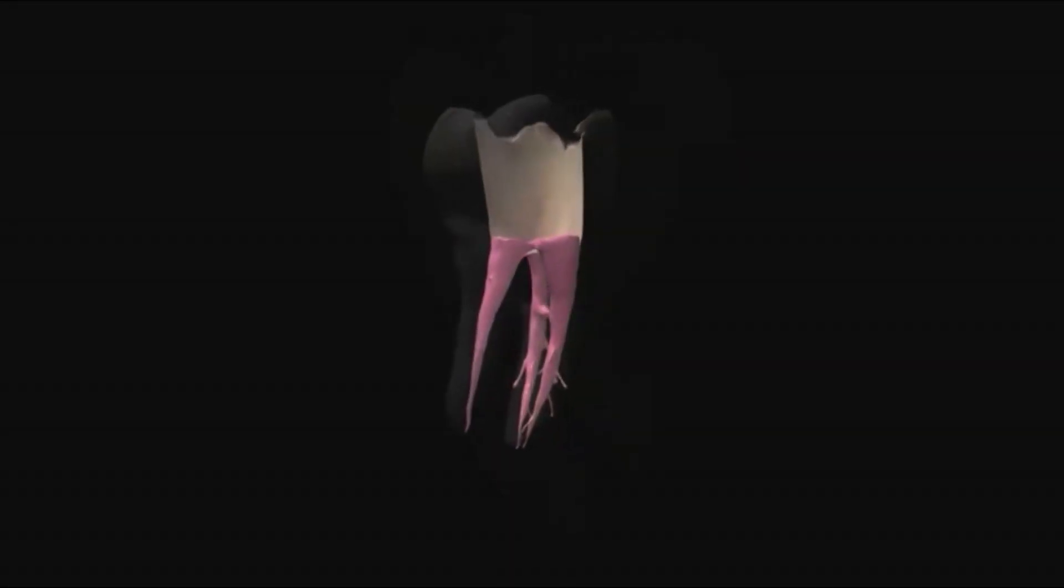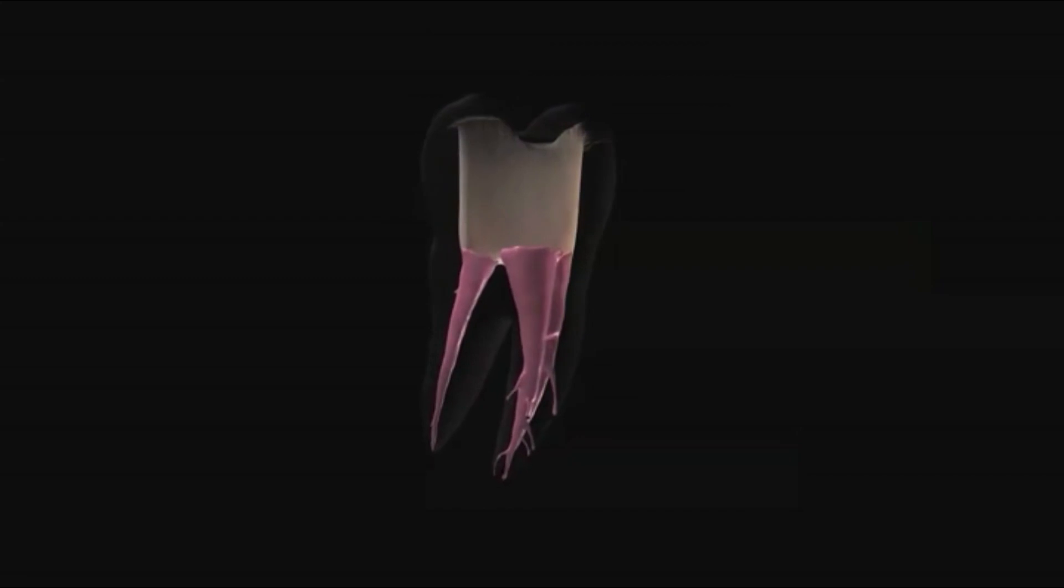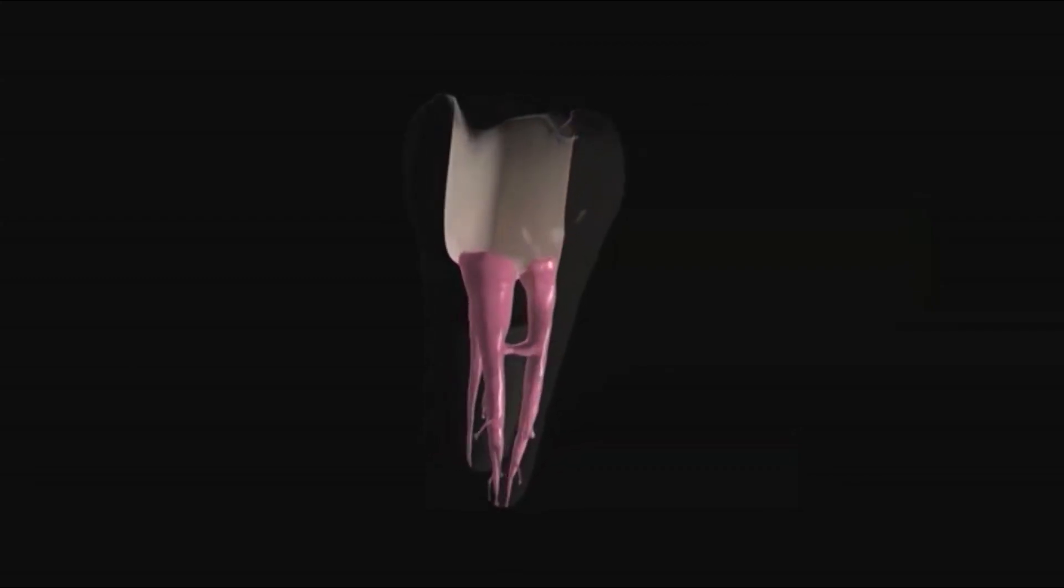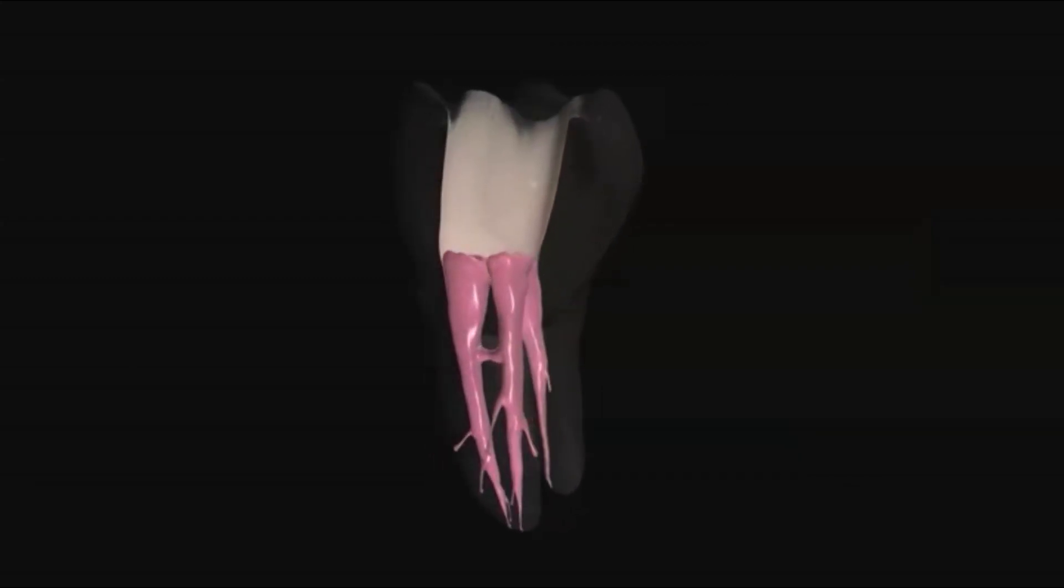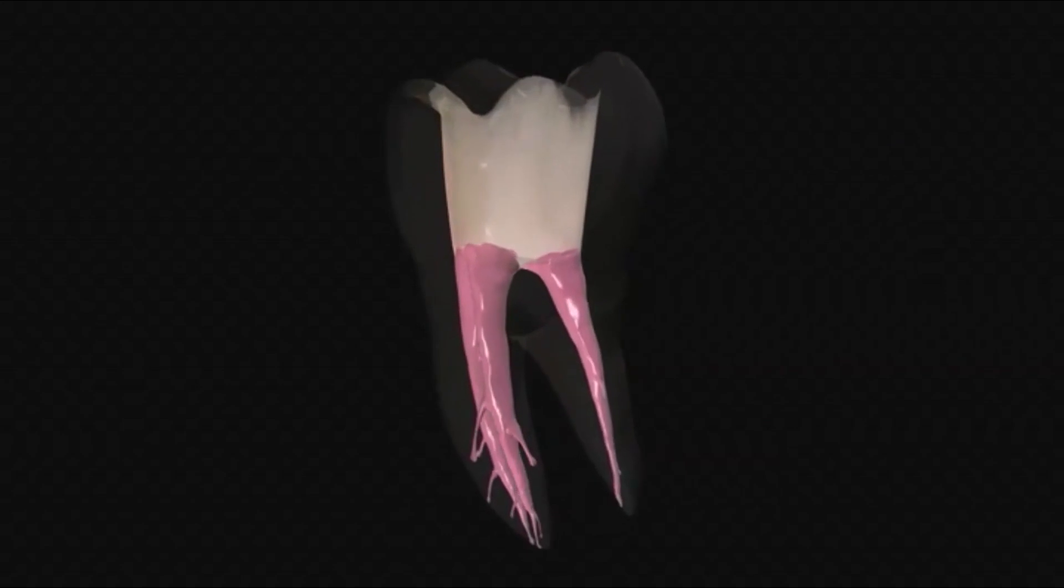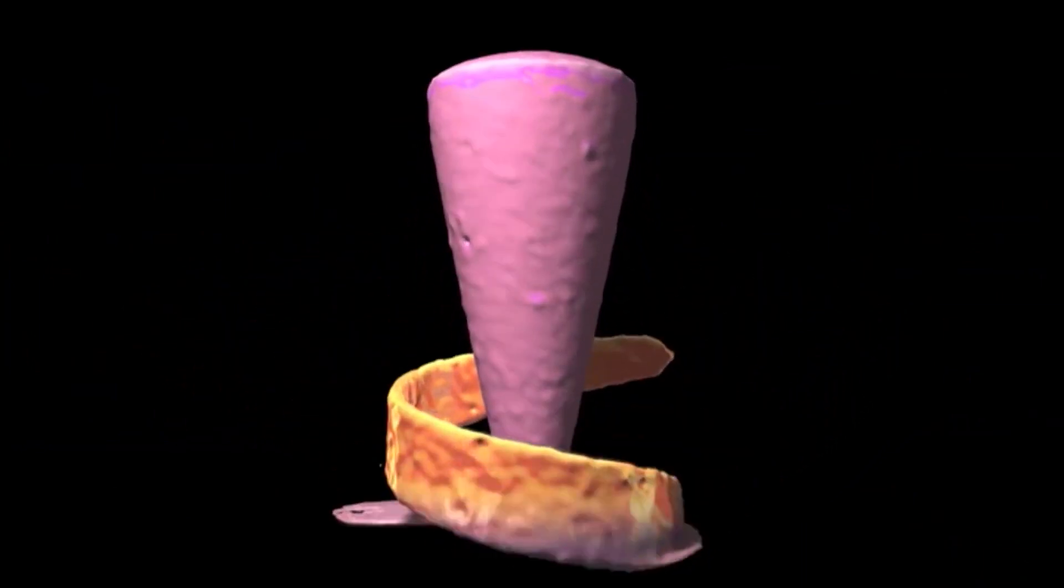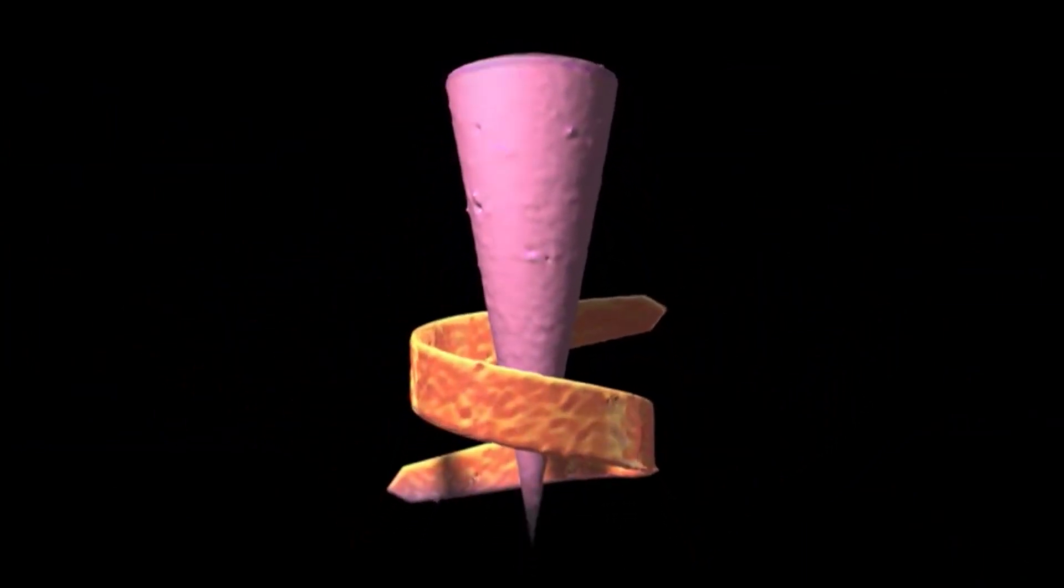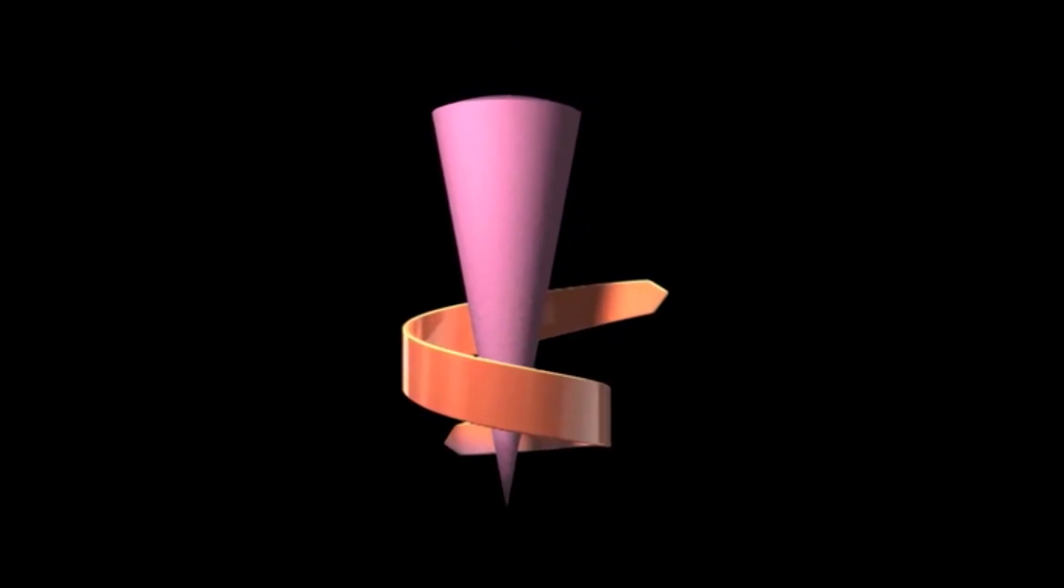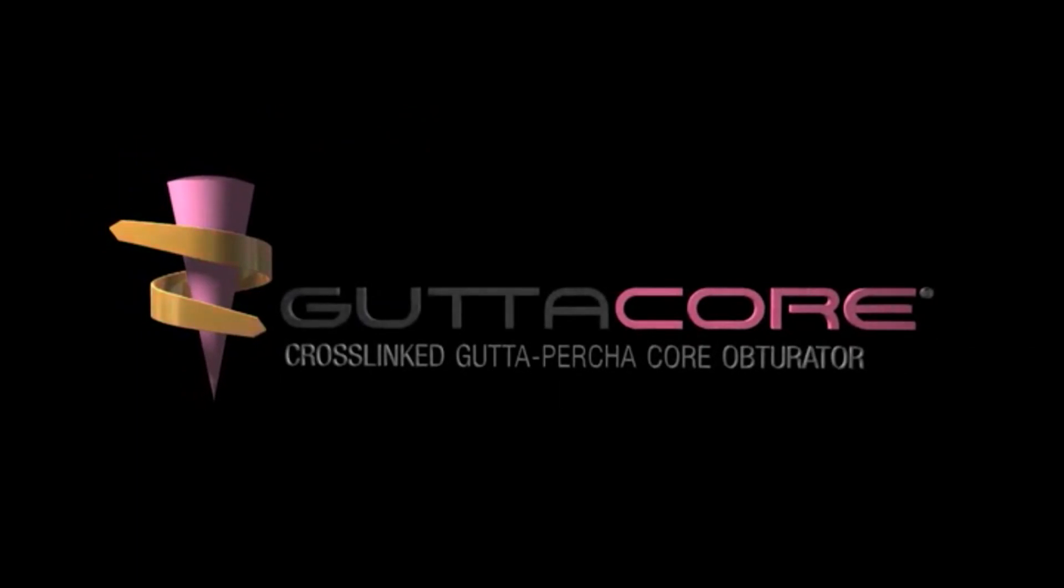GuttaCore, cross-linked Gutta-percha core obturators. Everything you know and trust about Gutta-percha, with the convenience and performance of a Dentsply Tulsa Dental Specialties obturator. Experience the GuttaCore difference, because it's what's inside that counts.